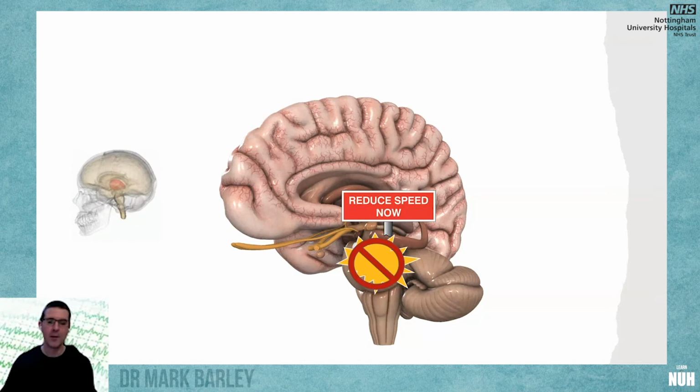This is breaking up conduction of signals from the thalamus to the frontal cortex. And with this slowing down, it's like putting the brakes on the traffic. Not as much information is going to get to the frontal cortex to produce consciousness. The brain wants fast signals. It's only getting slow signals. We can see that oscillation in the EEG.